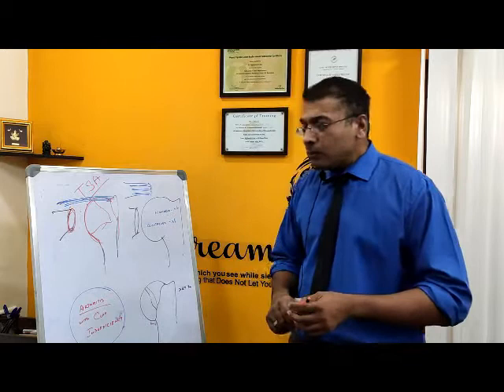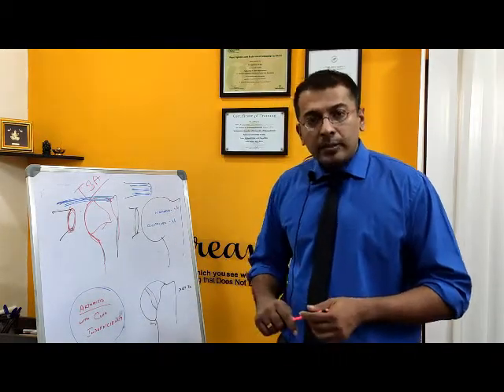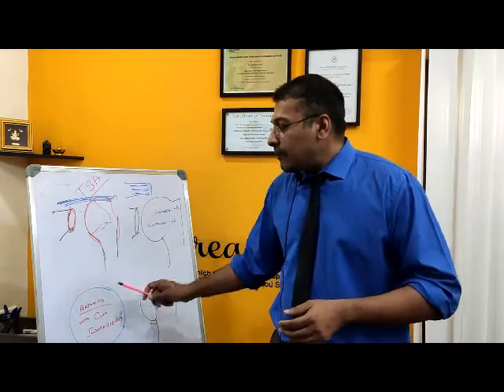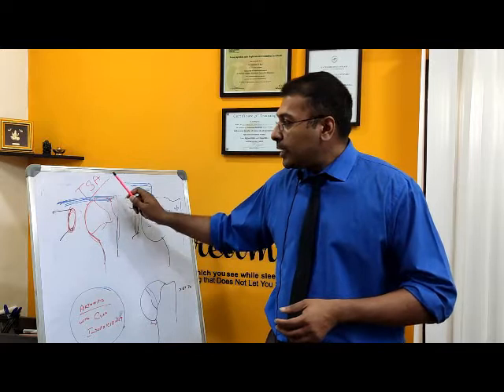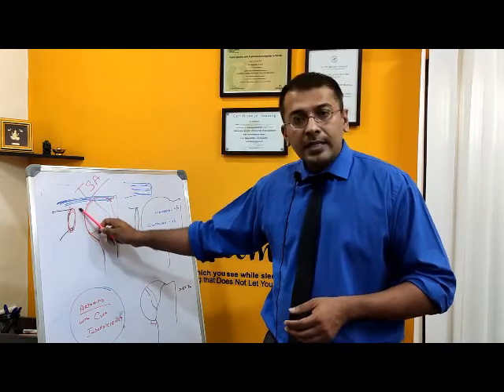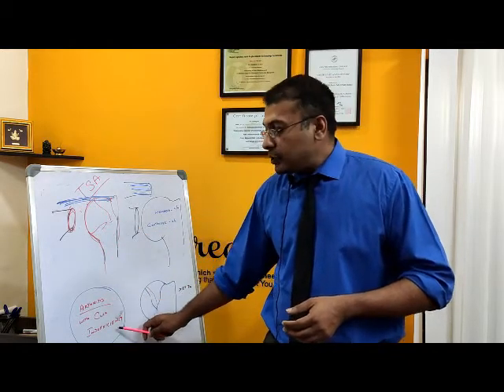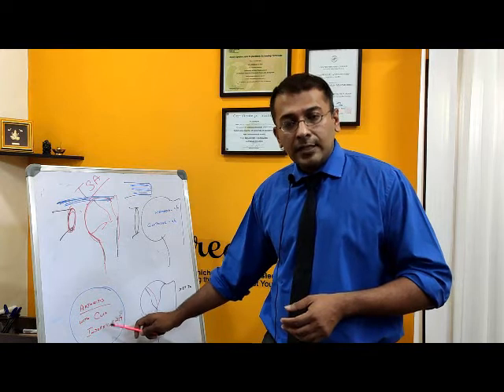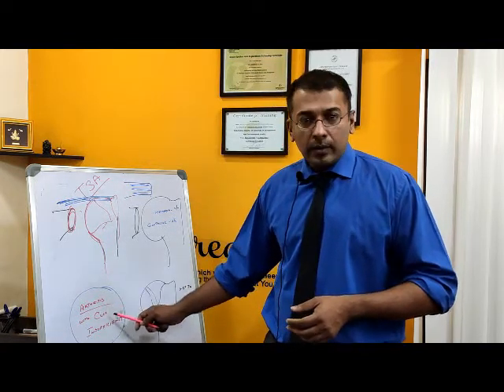Lastly, we also do a reverse shoulder replacement in conditions where there is severe arthritis. I was telling you earlier that a total shoulder is done in severe arthritis where the cuff is intact. If there is severe arthritis and the muscle is not there, or there is muscle insufficiency, or the muscle is torn, then we have to do a reverse shoulder.